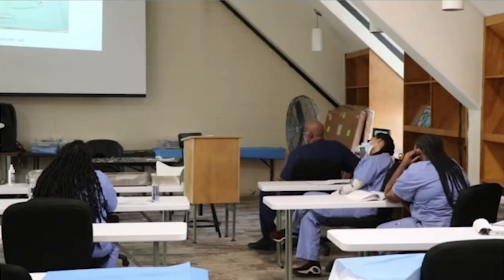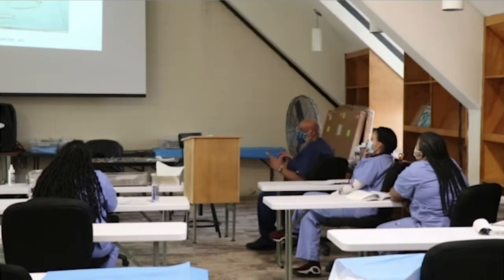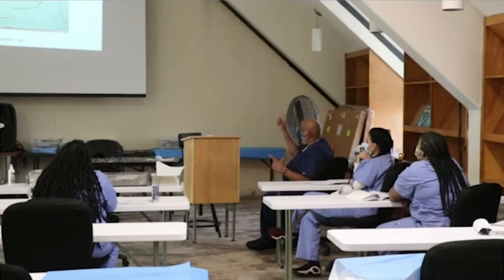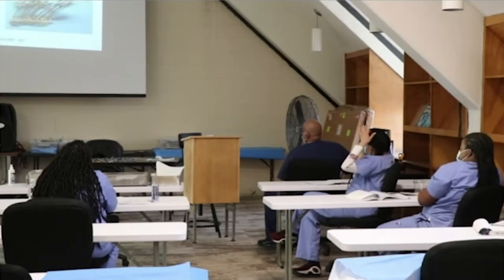Now this item here is one of those that's used for positioning inside. Remember I was telling you, the tray in the tray, like we use the bags, that would go in there. I'm hoping that one shows up in the presentation so I can show you better than I'm telling you. Those are holders.